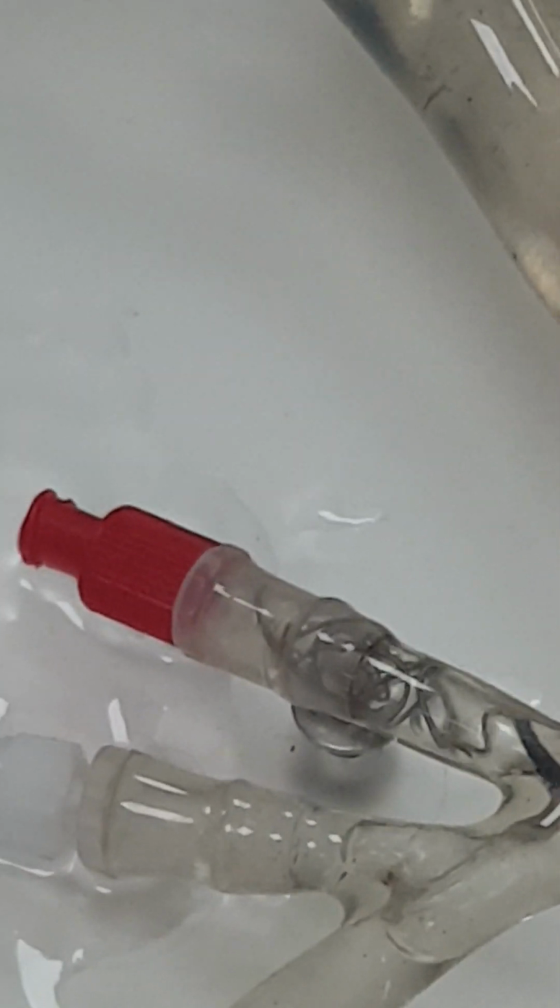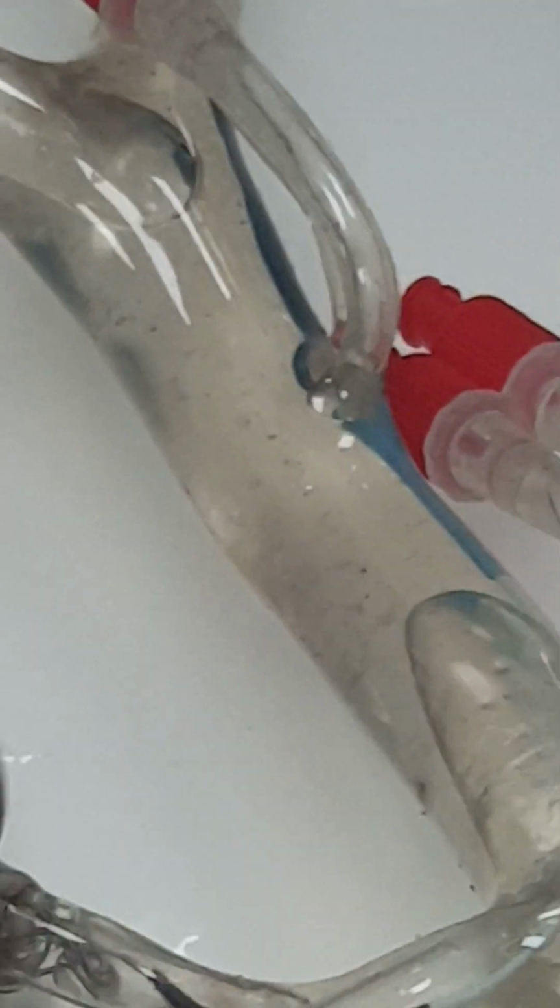And how much packing do you do compared to the diameter? There is an equation that you use. You do a 20% upsizing. So you measure the vessel. If you have a 4 millimeter vessel, you take a 5 or 6 millimeter coil in diameter.